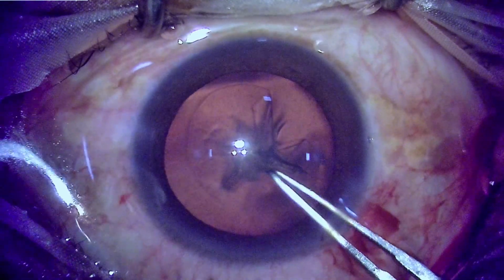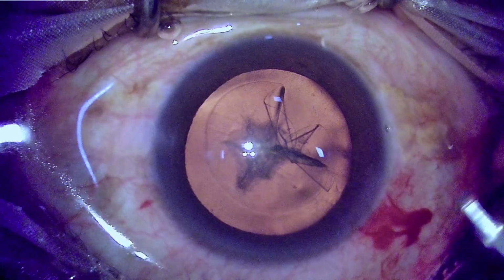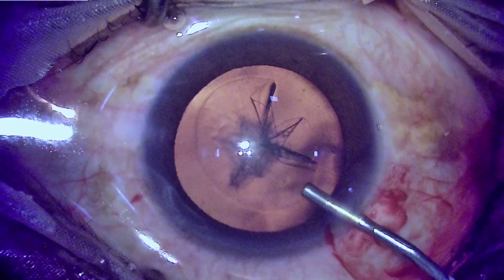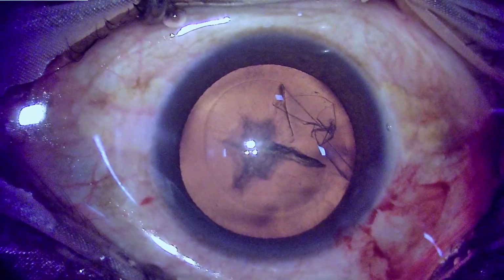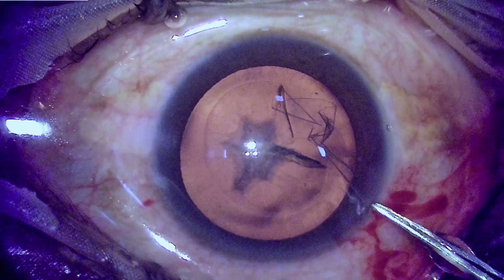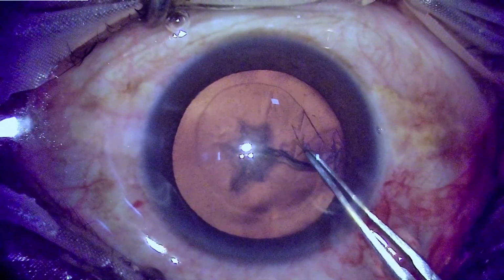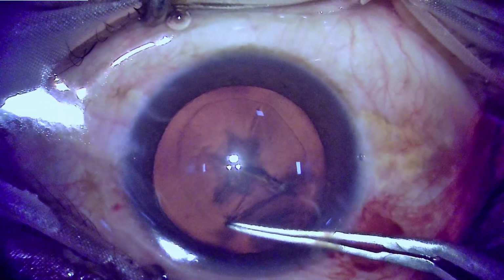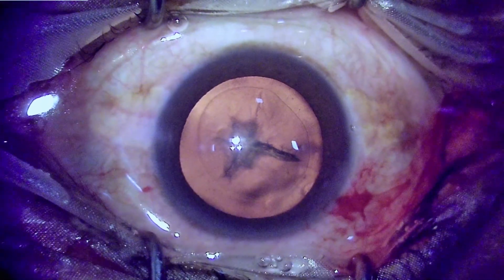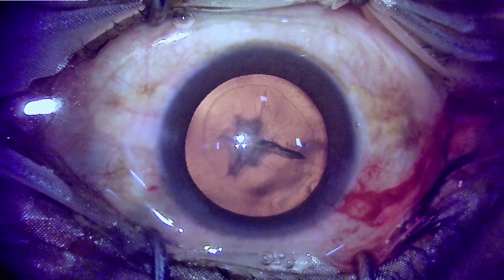The rhexis is restarted and we'll see the chamber is again getting shallow and the rhexis is running out, and if one can identify these events timely, it can be manipulated by deepening the chamber repeatedly and then proceeding for the remaining part of the rhexis, as has been done here. So although the rhexis is a little eccentric, it is still intact and complete. So now proceeding on to the phacoemulsification process.